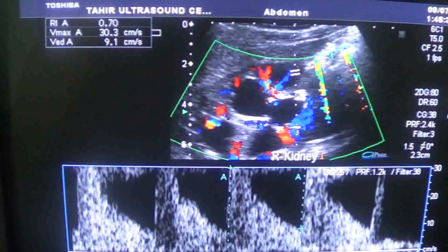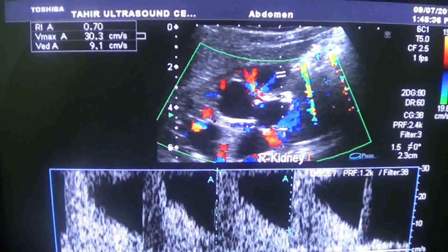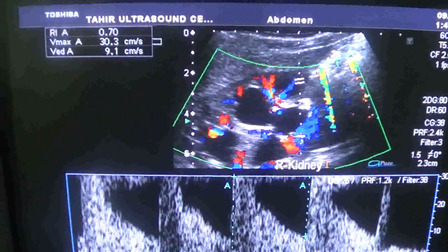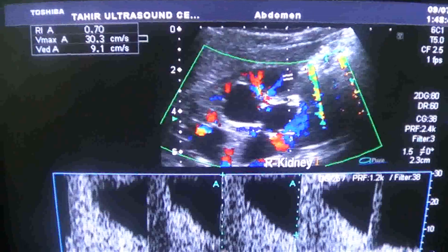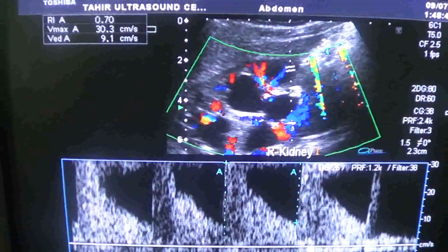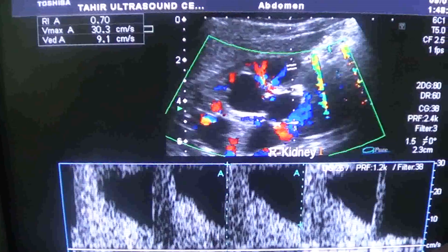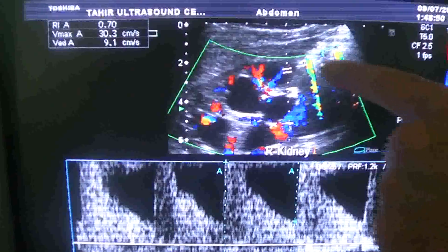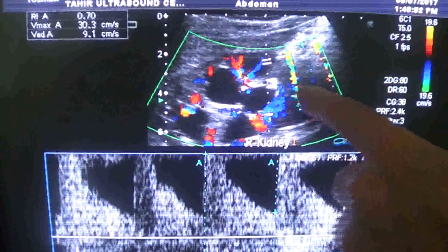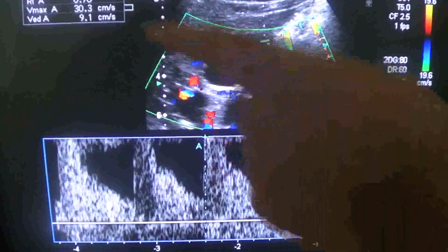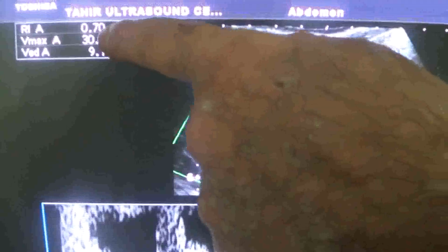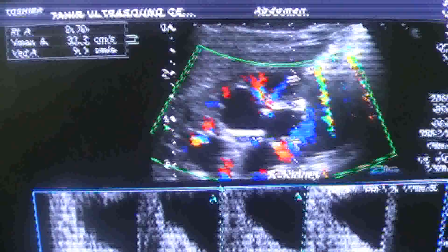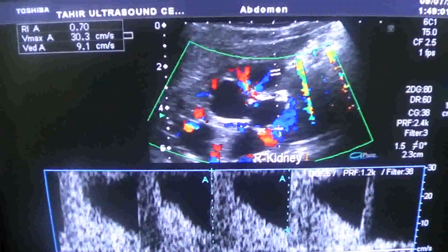This is an image, a frozen image, of a right kidney. The patient is 5 years old, male. We are seeing the right kidney — the parenchyma is being perfused normally, the calyces are dilated, and the resistive index is 0.70, which is within normal range, and the waveform of this kidney is normal.